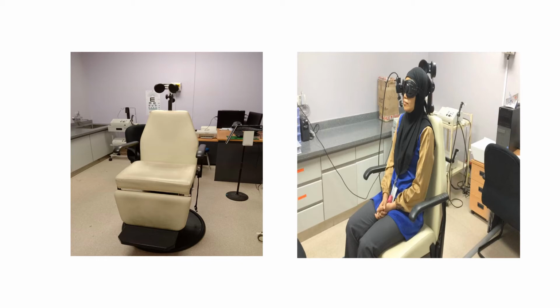The goggles shown in this picture are monocular goggles, but for the oculomotor VNG test, it's best to use binocular goggles, where both eyes can be seen. After that, instructions will be given for each subtest, and the room lights will be turned off before the test is carried out.